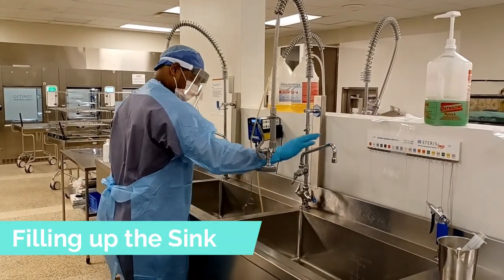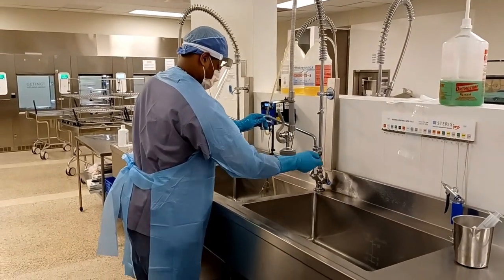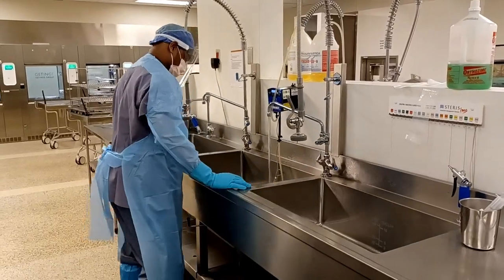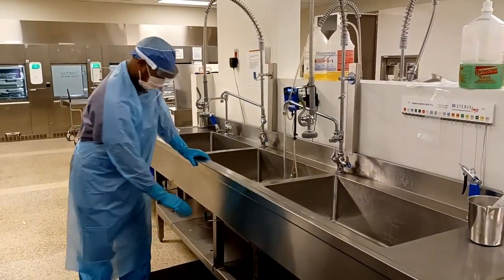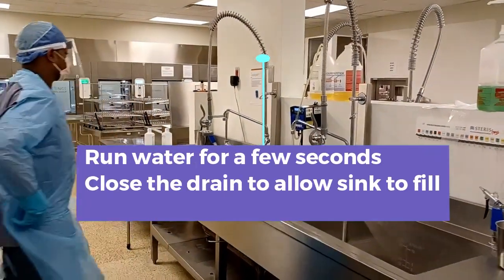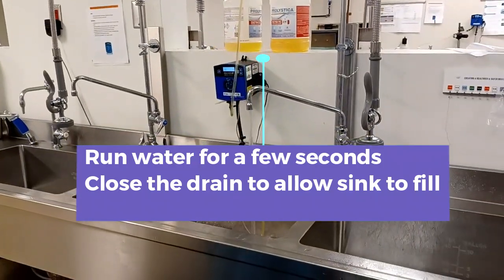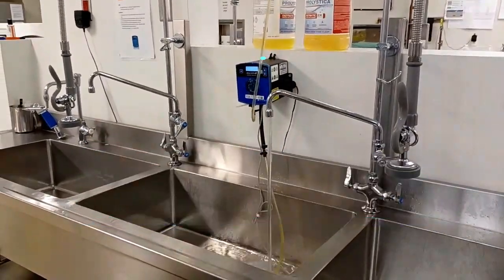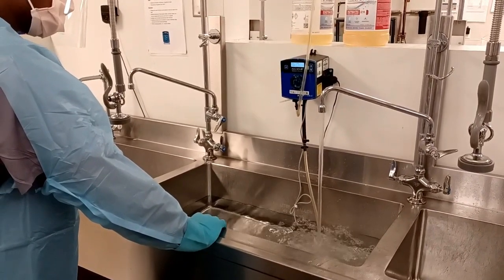Filling up your sink in decontamination. First, you want to allow the water to run for a few seconds. This allows the water to warm up before you turn the handle to close the drain. Your water in your sink must remain between 99 and 116 degrees. This allows the enzymatic to properly break down all the bio burden on the trays and the instrumentation.